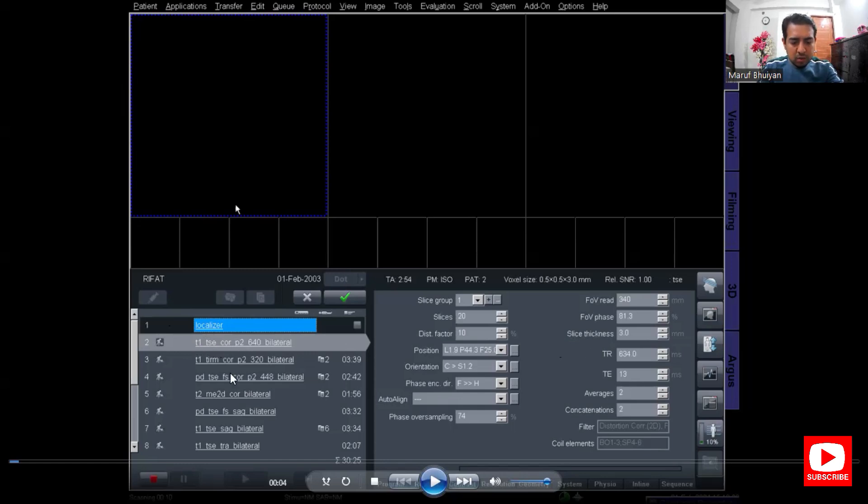First introduce the protocol. There is a localizer for planning, then two T1 coronal sequences: T1 coronal and STIR coronal, then PD fat sat coronal, and T2 or T2 star coronal — four coronals total. I will keep two coronal and delete the T2 star coronal and T1 TIRM coronal. For sagittal, there is PD fat sat sagittal and T1 sagittal — I will keep PD fat sat sagittal and delete T1 sagittal.